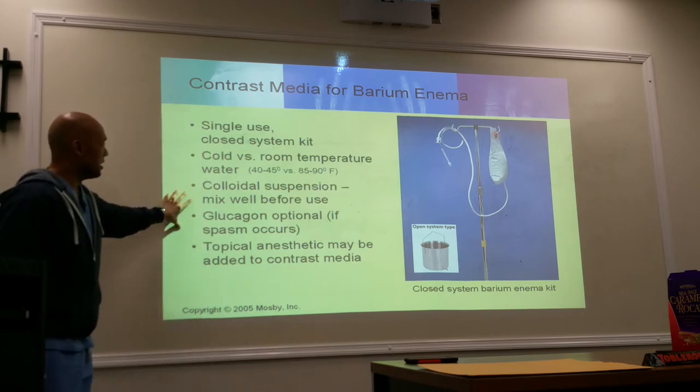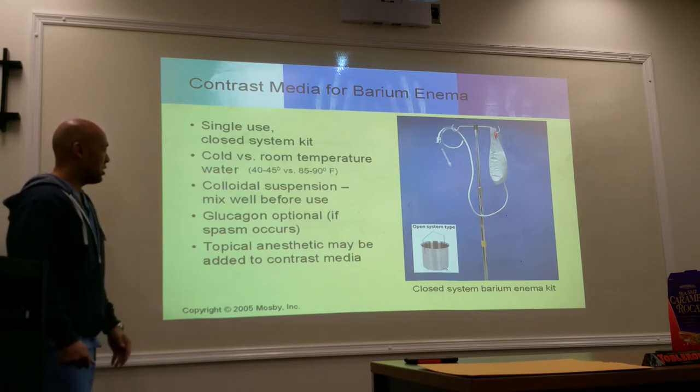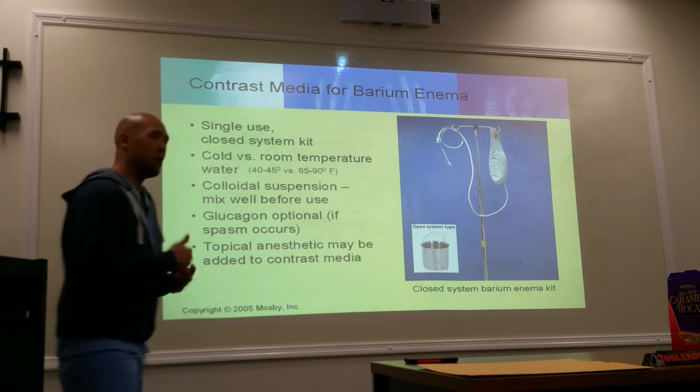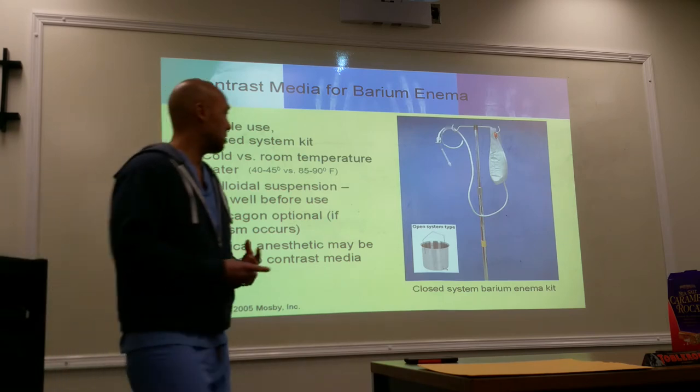So again, colloidal suspension, mix well before use. Have glucagon ready if spasm occurs. A topical anesthetic, like lidocaine, may be added to the contrast media to help ease any type of pain they have in the intestines.